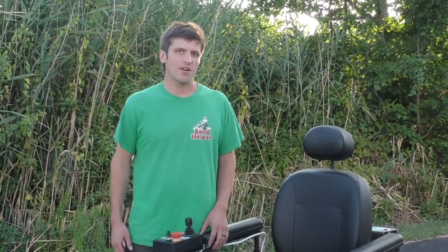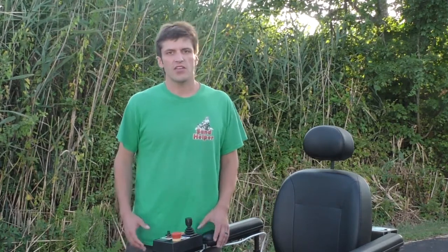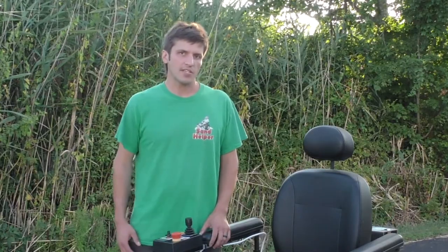Hi, my name is Nick here at Sandhelper, and we are going to briefly go over the operations of the wheelchair so that you can start your vacation off on a great note using the Sandhelper Beach wheelchair.